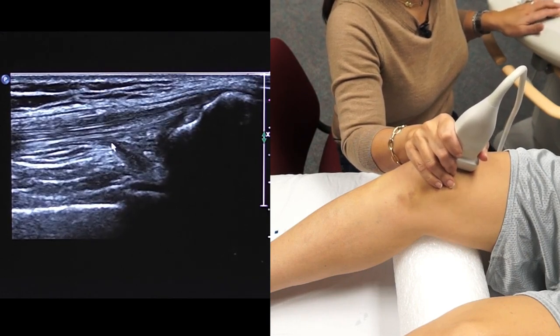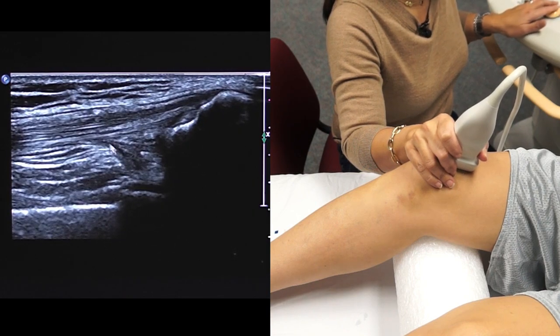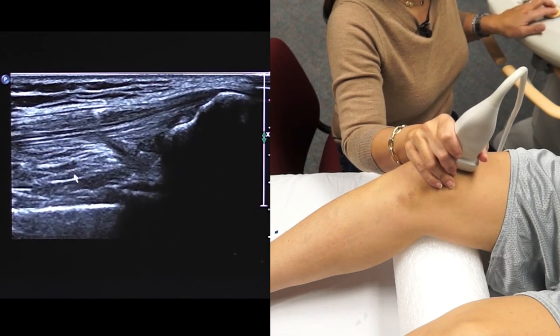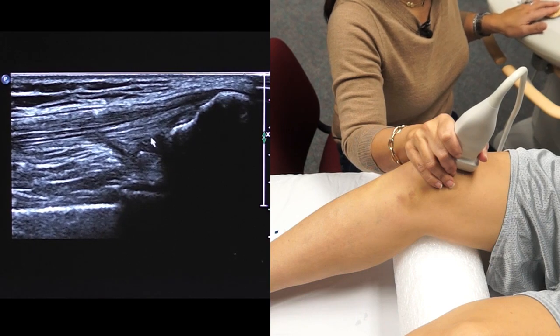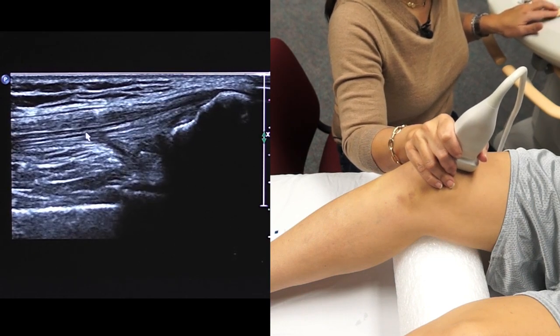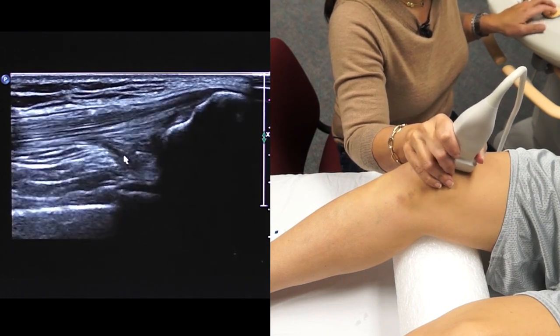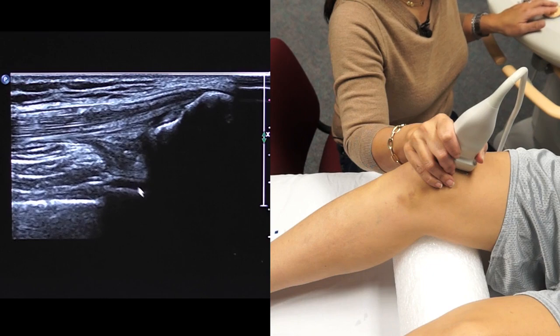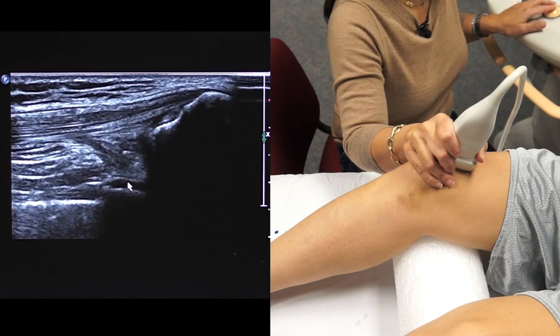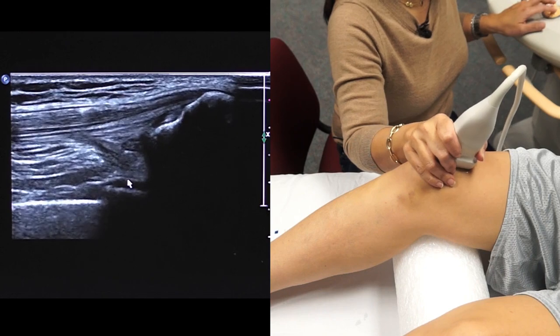And if you notice, there is a hypoechoic or anechoic cleft here, which is separating the prefemoral fat pad from the suprapatellar fat pad. And when you see this cleft widen, or if you see fluid in this space, that may indicate a joint effusion. Also note you see a little bit of the distal femoral cartilage, which is not to be mistaken for fluid or a joint effusion.